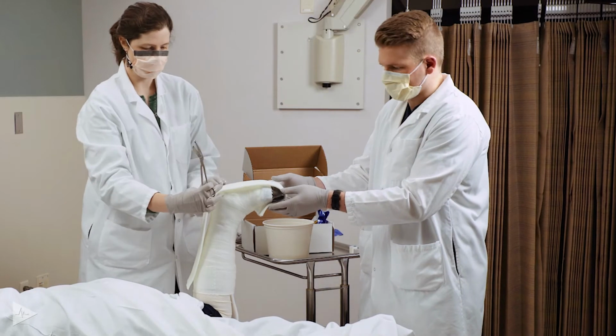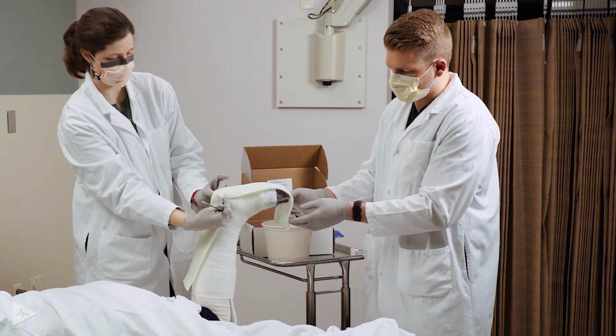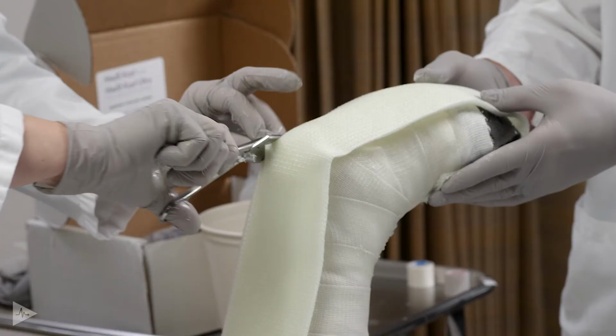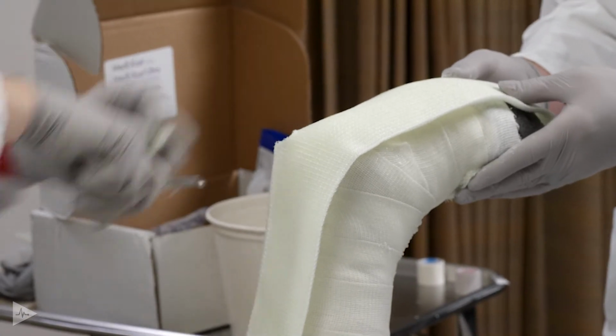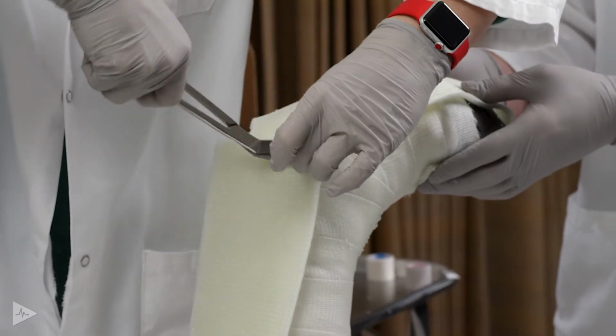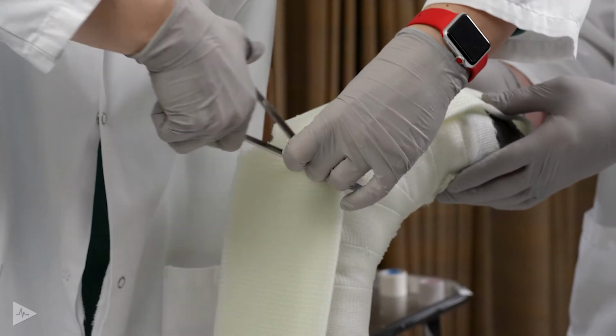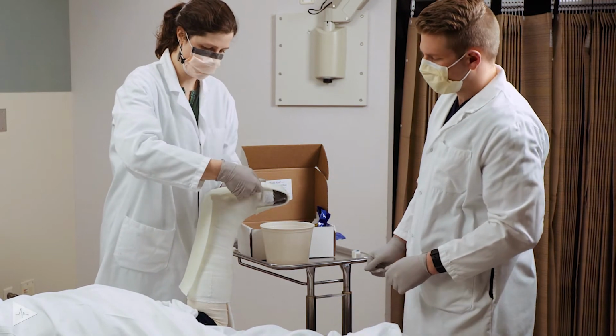And then we will also want to trim the edges because then as we're wrapping the cast, those will lay flatter if we can remove these pucker areas. Then you will want to find the arch of the foot.